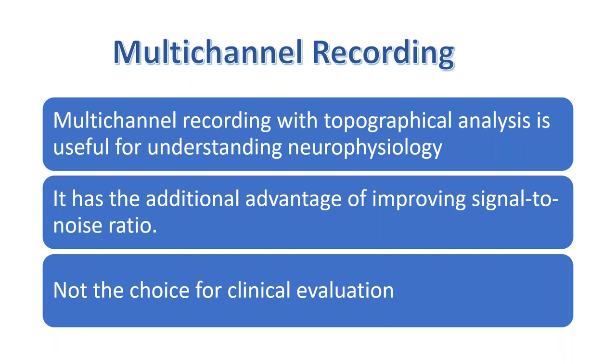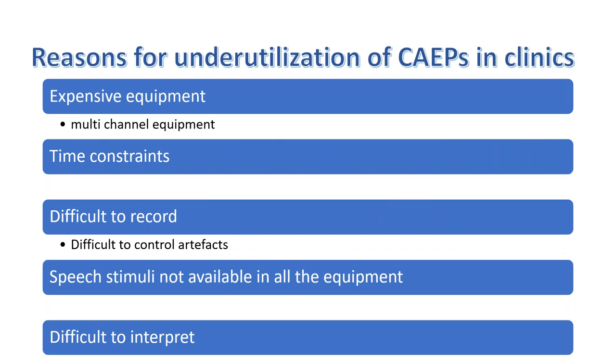And we all know that in everyday clinics, the majority of clinicians are not using cortical evoked potentials. So why is it that we don't use cortical evoked potentials in everyday practice, what we call underutilization of cortical auditory evoked potentials? One, people feel that the instrument is expensive if you have to go for a multi-channel equipment. And then there are time constraints.